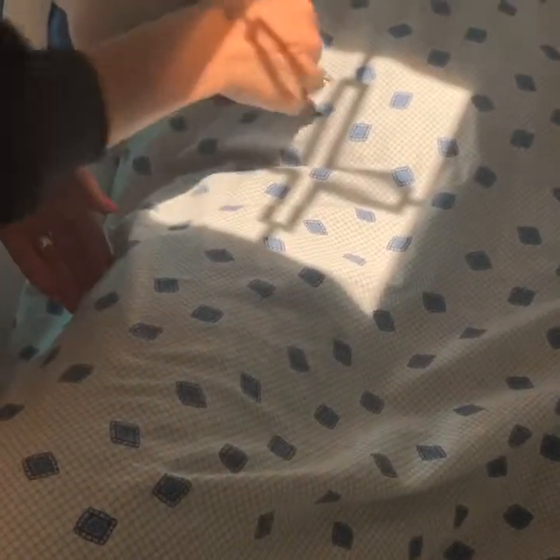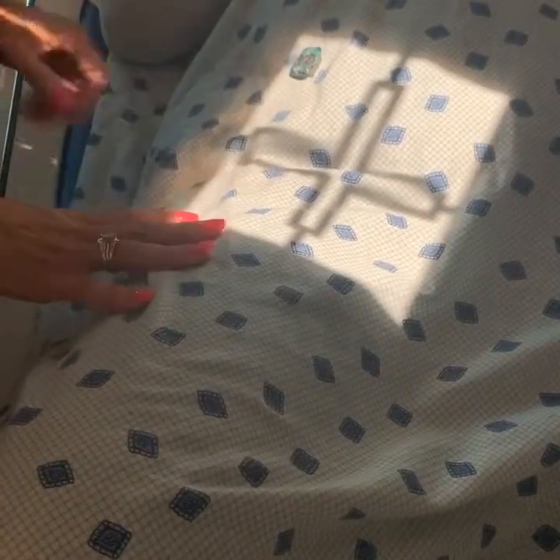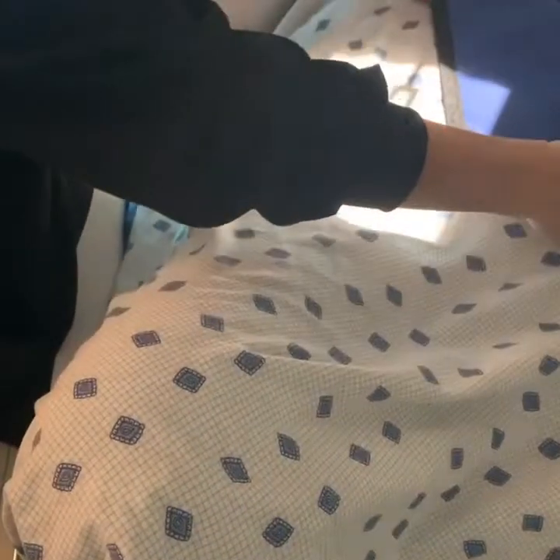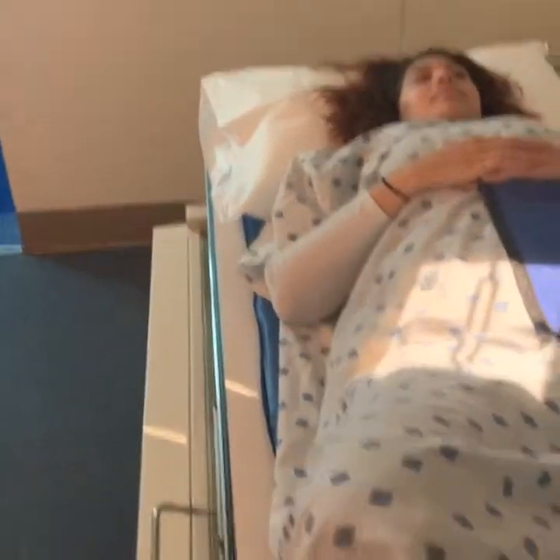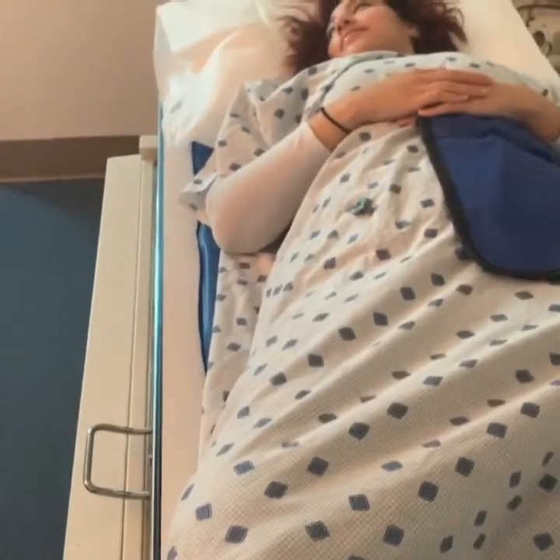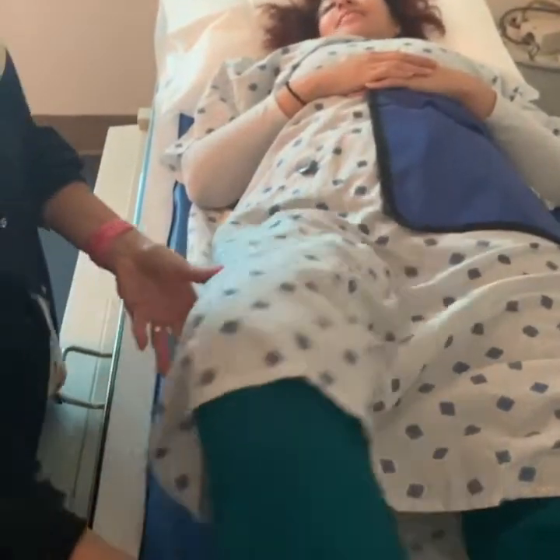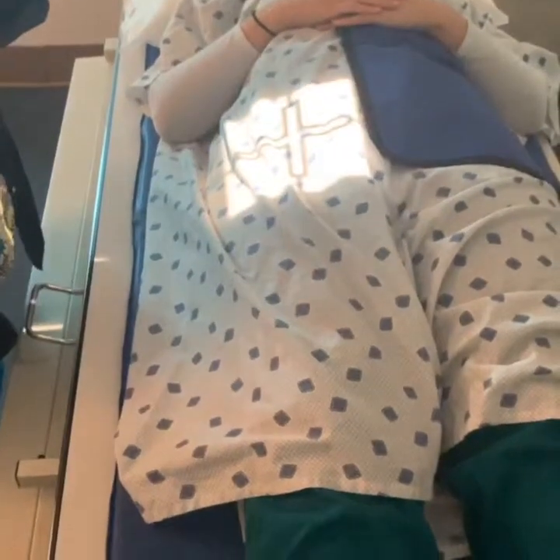And then I would put the marker, I'd probably stick it up there for this one, just because I know I'm not gonna be in the way of that. I know it was lined up before, but it doesn't make sense to check it now because I've turned the tube head. All right, just like that. I could do the same thing and kind of lay it over here. You okay like that? Mm-hmm. All right, just like that. Just stop breathing for me. Beat, good. You can relax. Not too much. You can straighten it out. And now we're gonna do a lateral of the distal femur.